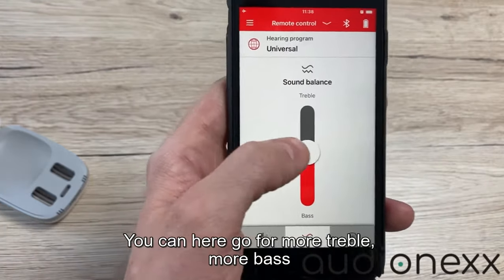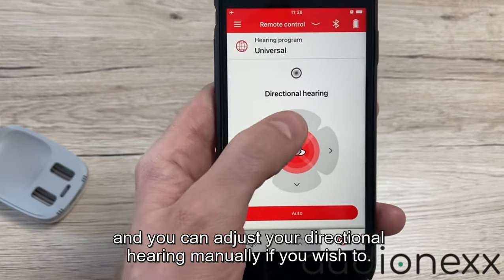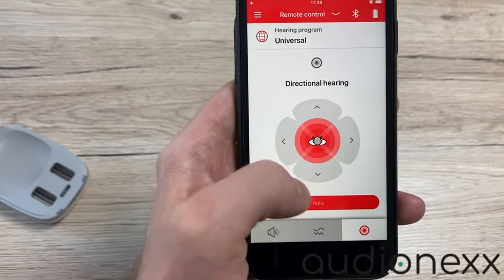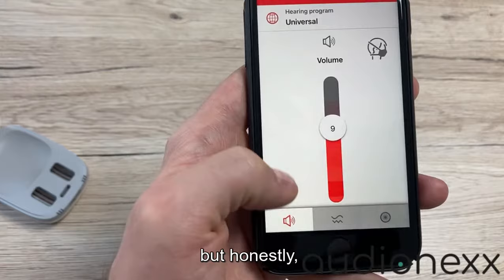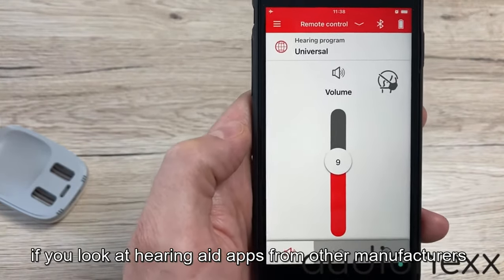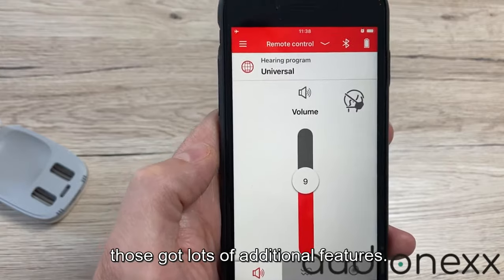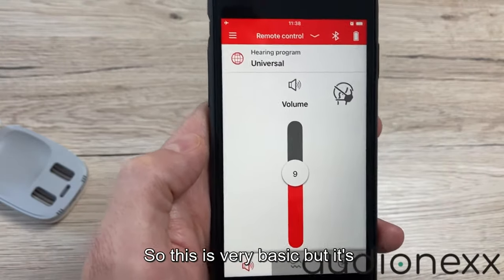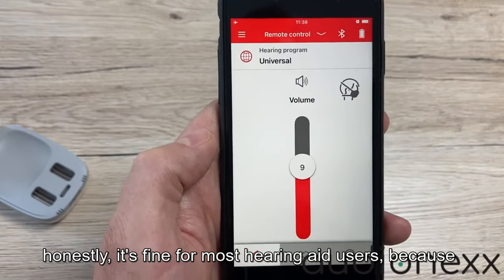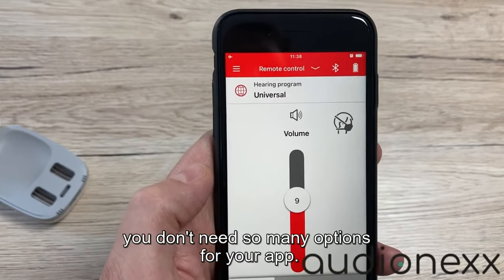You can go for more treble or more bass, and you can adjust your directional hearing manually if you wish to. It's pretty nice. But honestly, if you look at hearing aids from other manufacturers, those have lots of additional features — so this is very basic. Honestly though, it's fine for most hearing aid users because the hearing aids adjust themselves automatically and you don't need so many options in your app.